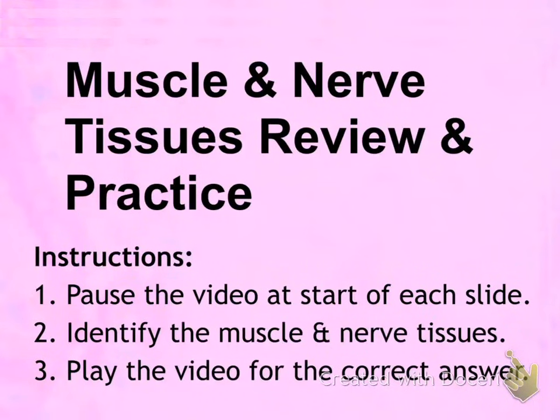This is the muscle and nerve tissue review and practice. The instruction is at the beginning of each video, pause the video, and then try to identify what type of muscle tissue it is and whether it's a nerve tissue, and then play the video in order to get the correct answer.